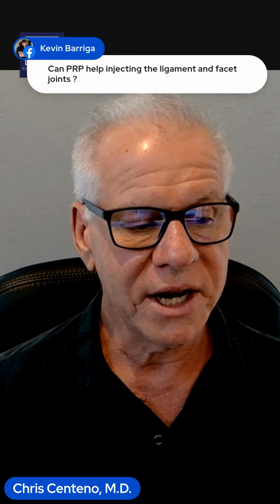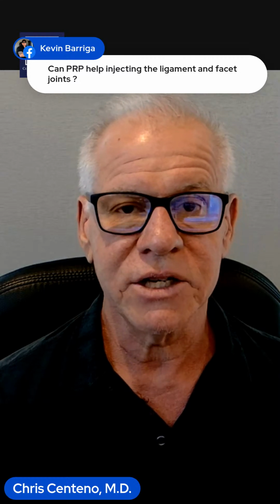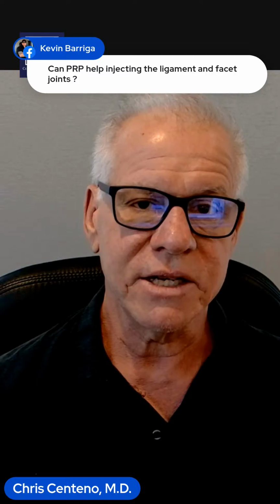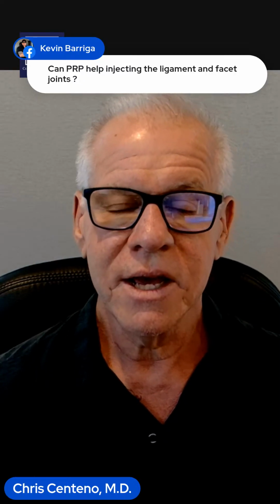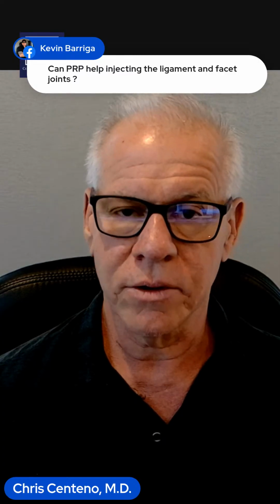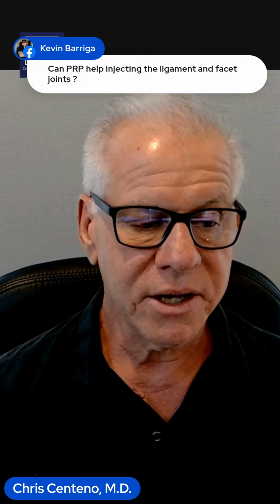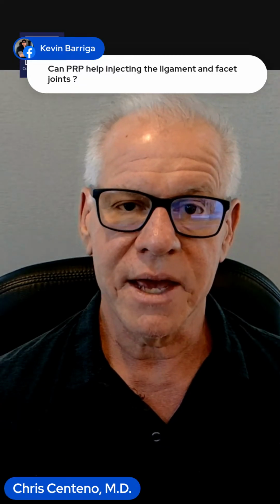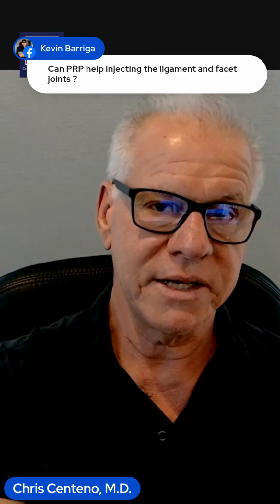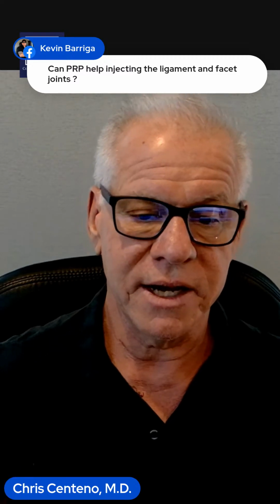Kevin, can PRP help injecting the ligament and facet joints? You know, Kevin, it can. The biggest thing to focus on there is if you're going to inject the facet joints, you really need fluoroscopy with contrast confirmation. You can do it under ultrasound. I just can't do it well and consistently under ultrasound because you can't make sure that you're in the joint. So my recommendation would be if you're going to get PRP injected in the ligaments, that's something that can be done under ultrasound. If you want it in the joints, it's got to be ultrasound plus fluoroscopy with contrast. And the answer is yes, it can be injected in both places.